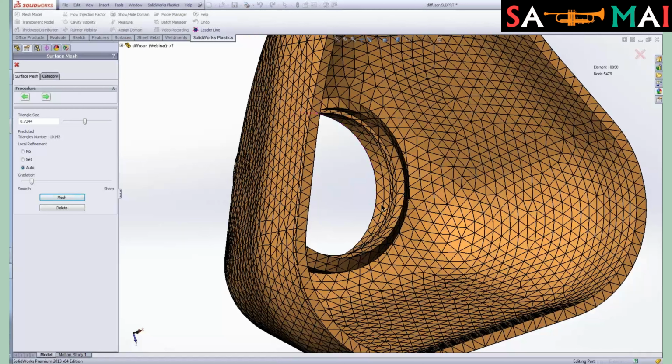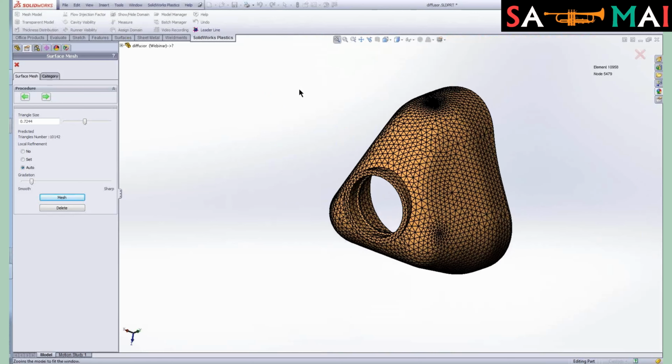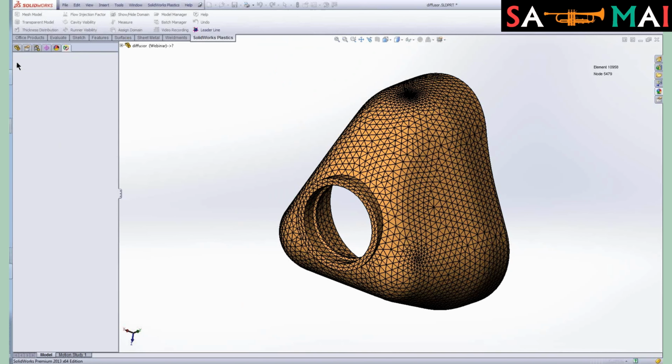As I rotate it around, I can check and make sure that features such as there's a thin rib on the inside or the ID of this diffuser. That's where the elbow for the oxy arm gets put in. I want to make sure that I can see that. Since it is in the part, I should be good to proceed with the rest of this analysis. So there's our surface mesh.